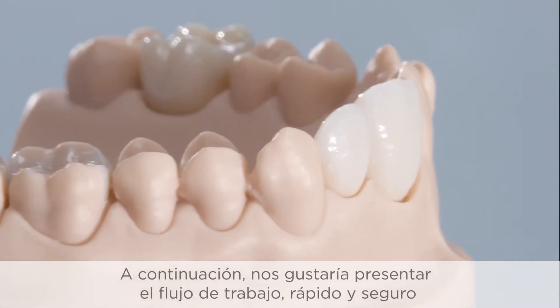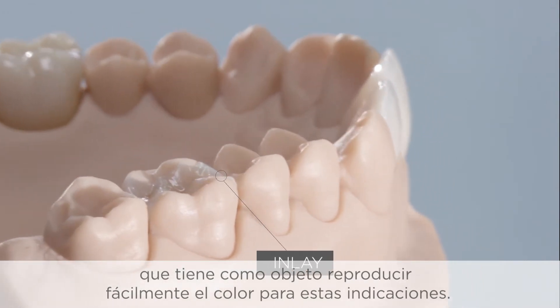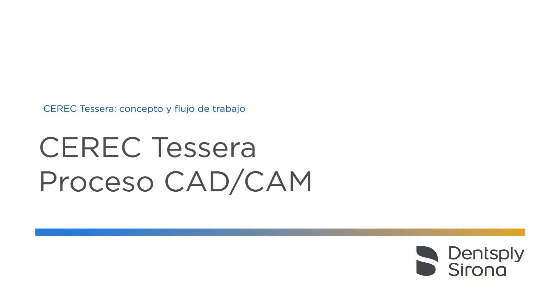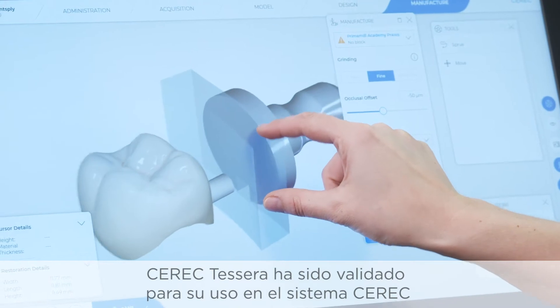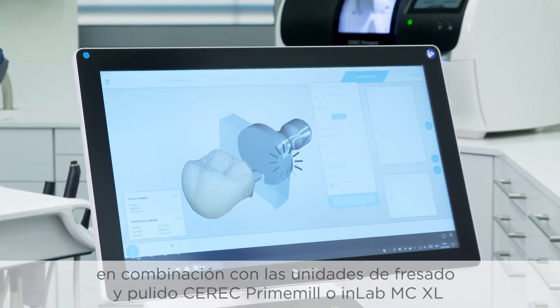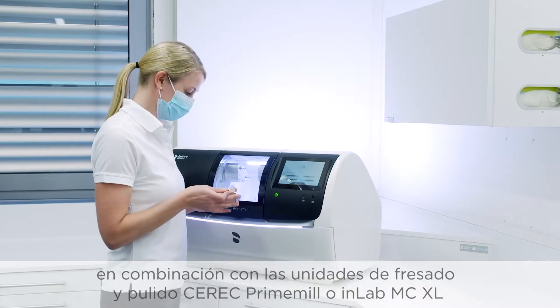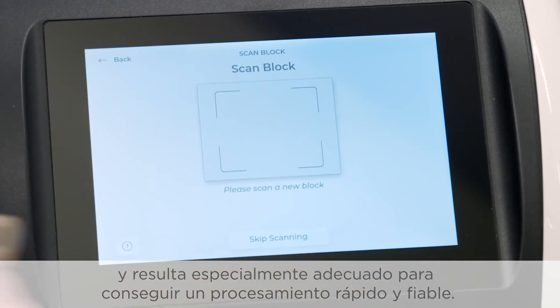In the following, we would like to present the fast, safe workflow with the aim of easy color reproduction for these indications. Seric Tessera has been validated for use in the Seric system in combination with Seric's Prime Mill or InLab MCXL as a milling and grinding machine, and is particularly suitable for fast and reliable processing.